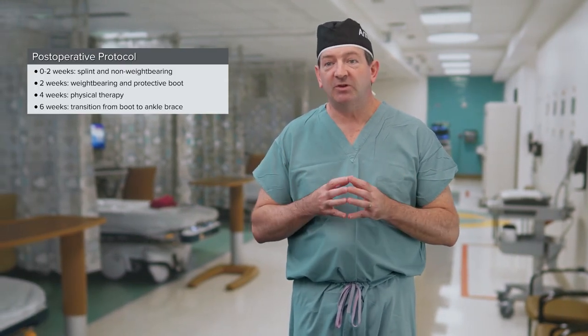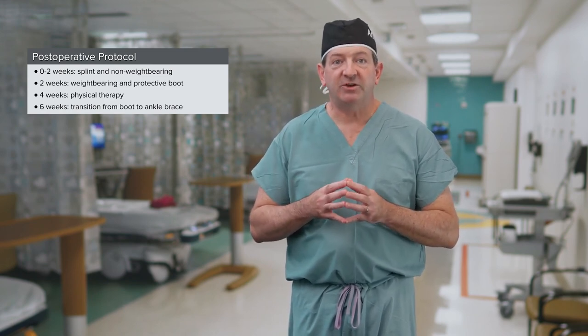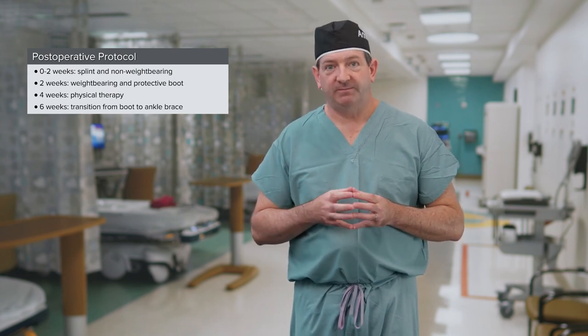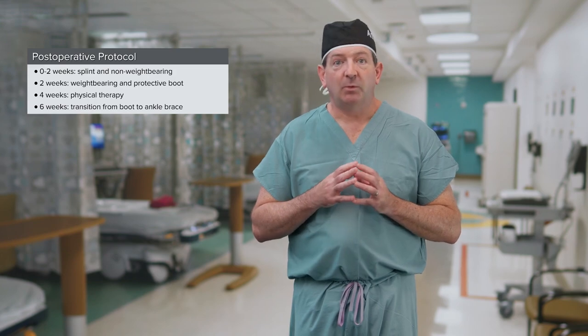My post-op protocol is as follows: the patient is splinted for two weeks non-weight-bearing. At two weeks, sutures are removed and the patient is made weight-bearing in a protective boot. At four weeks, the patient starts physical therapy. And at six weeks, we transition from a boot to an ankle brace.